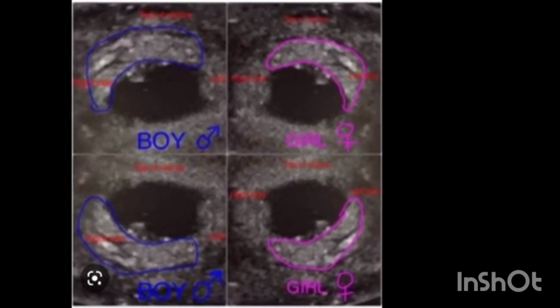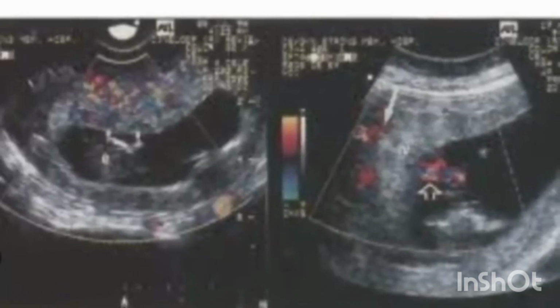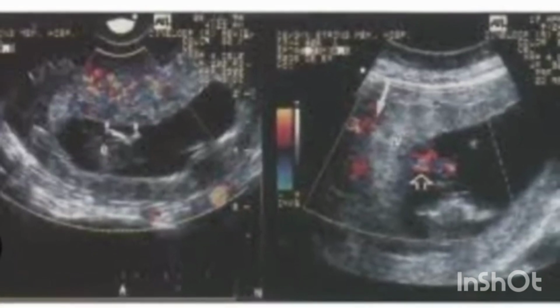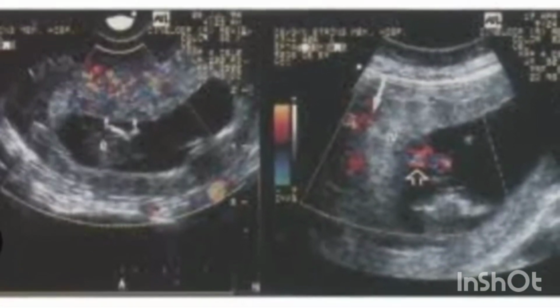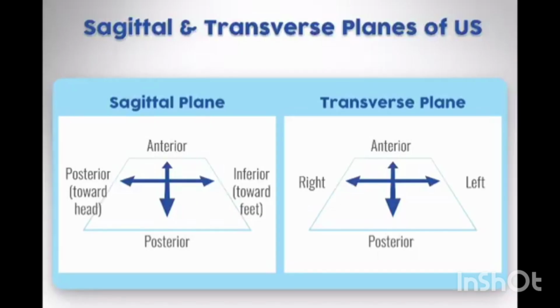forming at 6 weeks. During the development of the theory, they used color Doppler to establish the site where the chorionic villi were forming. Without the use of color Doppler, it would probably be more clear if the cord insertion is clearly visible. A specific view would need to be obtained to see this, that is, a transverse view which effectively shows a view as if looking through a cross-section of the uterus from the top, and when looking at the screen remember left is right and right is left. Just to confuse things, orientation is never what you think it is with ultrasound. With this view you can see which is left and which is right.